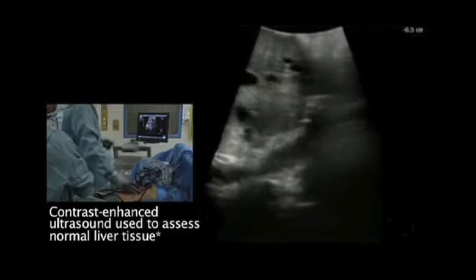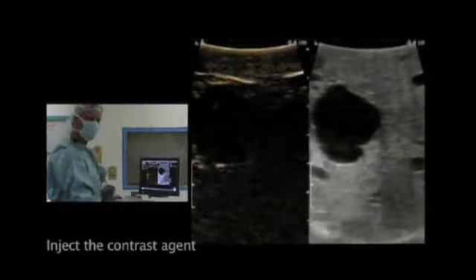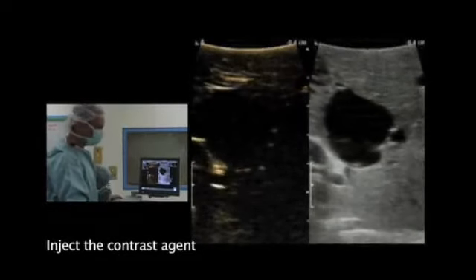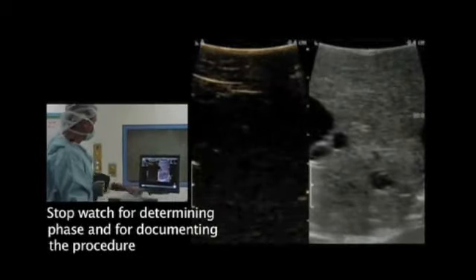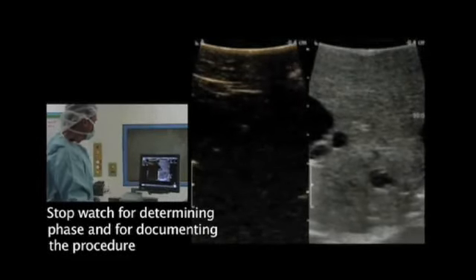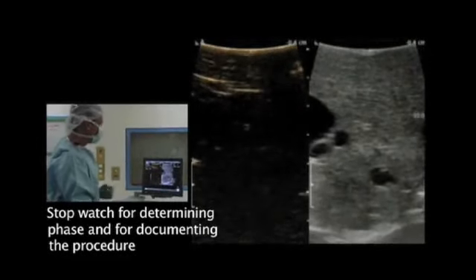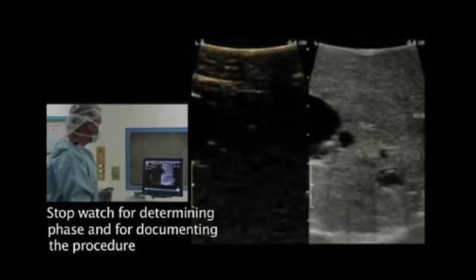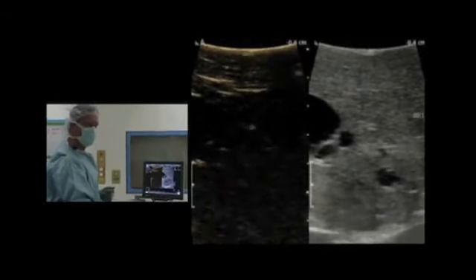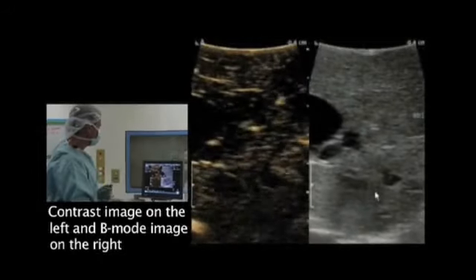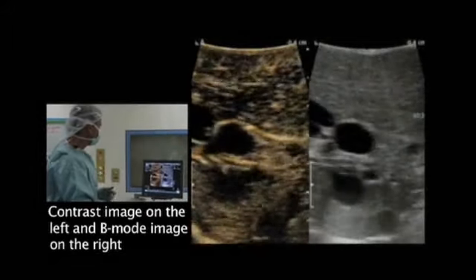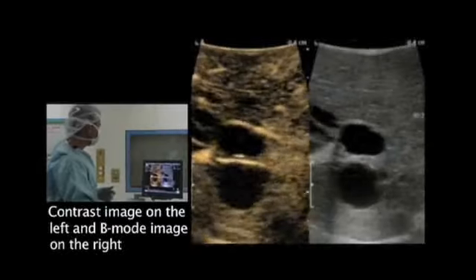So I think we will prepare the contrast. We inject the contrast, and at the same moment we start the injection, we will also start the stop clock, which we start counting up. That will provide us an idea about which phase we are looking at, and also used for documentation afterwards. We will have the contrast image on the left side of the screen corresponding to the guiding image in black and white ultrasound on the right side of the screen.